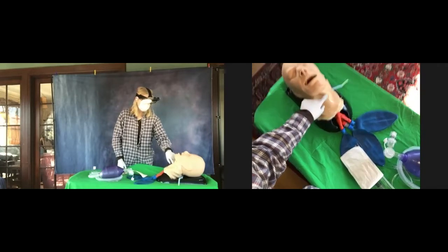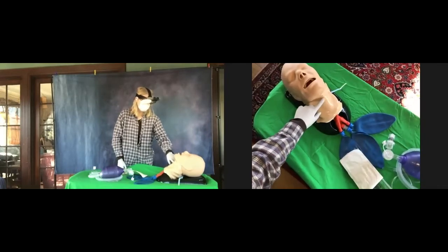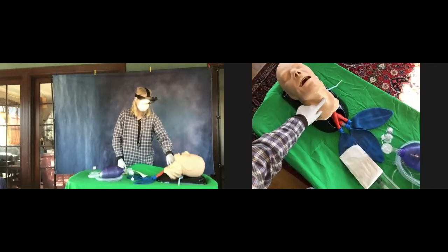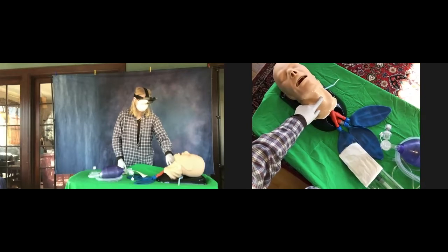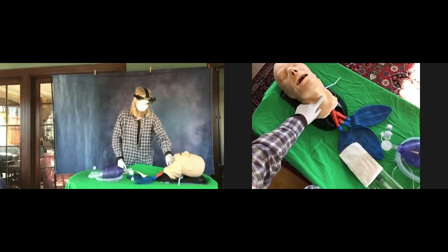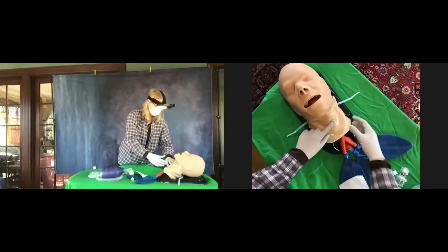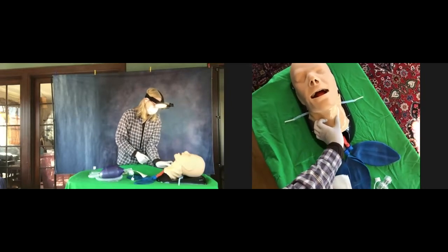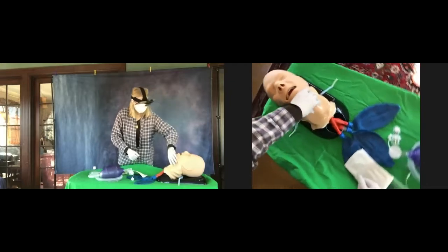You feel that? Go back to the soft spot. Now you're going to put your index finger and your thumb on either side of that soft spot and hold it nice and still. Use your left hand, but turn your hand the other way. There you go. Perfect.